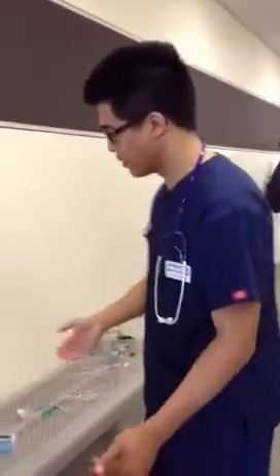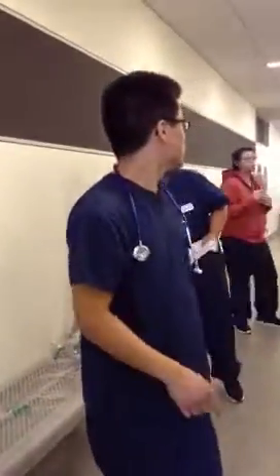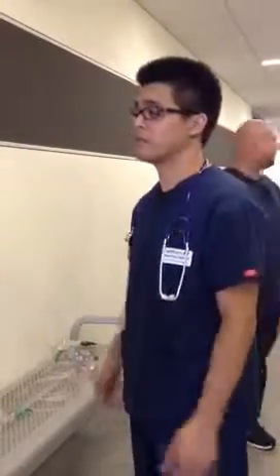Now before I start giving you your oxygen, I'm going to take the vitals. So I'll take the heart rate, breath sounds, which is also called auscultation. And I would ask the patient to cross their arms and lean forward so the scapula will pull away from the lungs so you can hear it better. And I would go side to side and then top to bottom or bottom to top. The most important is side to side first because you're comparing 2 lobes. You're not comparing 1 lung.